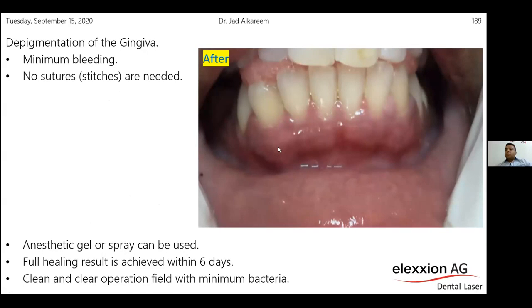So there is a question about the fibers, the difference between the initiated and non-initiated fibers. Initiated fibers means that the fiber is going to cut the tissue. Non-initiated, or uninitiated, fibers don't have the ability to cut the tissue, but will only disinfect the surface. So that's the difference between the initiated and non-initiated.